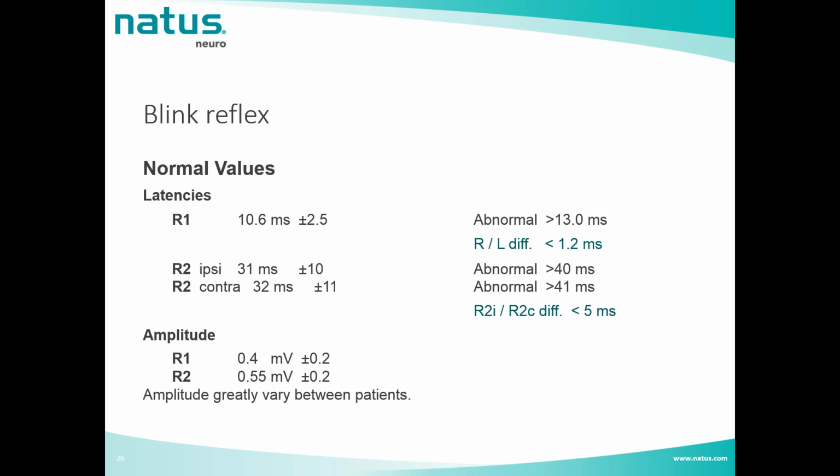Clinical papers also provide a range of amplitude for R1 and R2 in patients. However, the amplitude is always said to greatly vary between patients. The main focus is done on latencies more than amplitude.